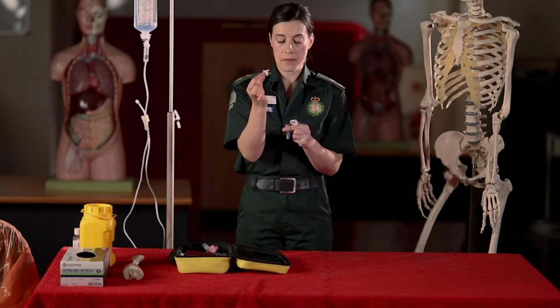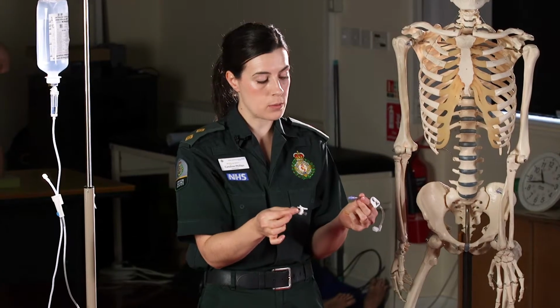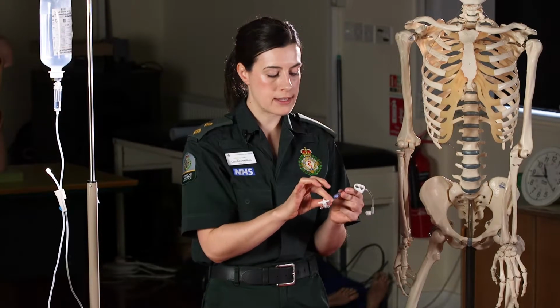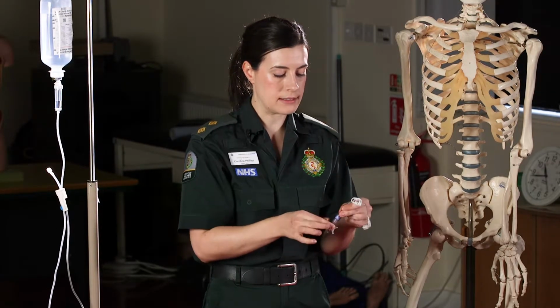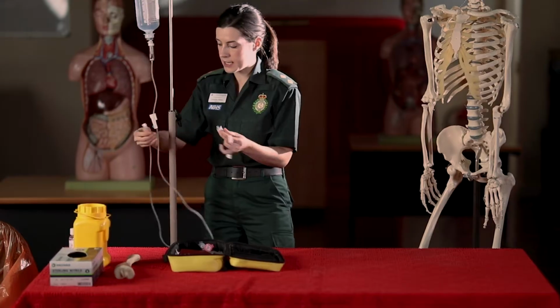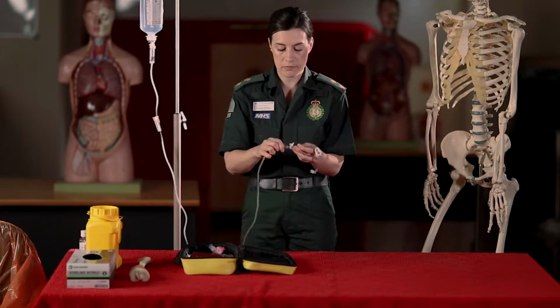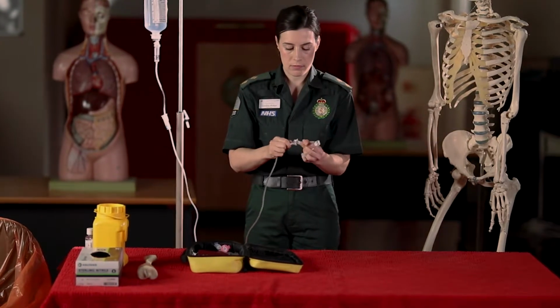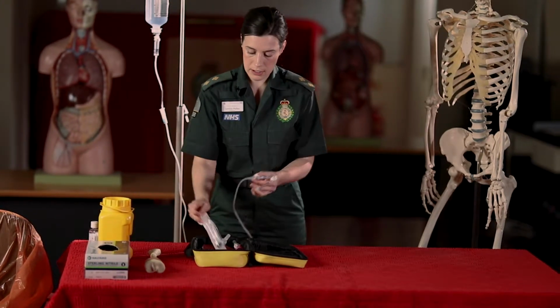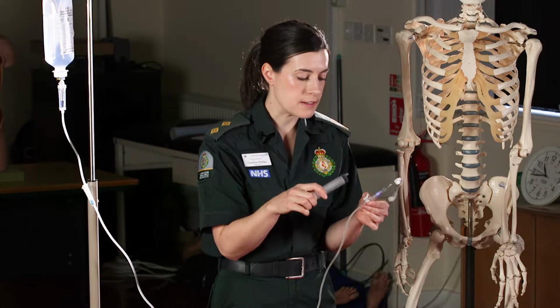and my 3-way tap. So being careful not to touch the key parts of this equipment, I'm going to attach the 3-way tap by pressing and twisting the ends together. I will then attach this to the end of the giving set, again being careful not to touch the key parts. The third element of connection is my syringe.